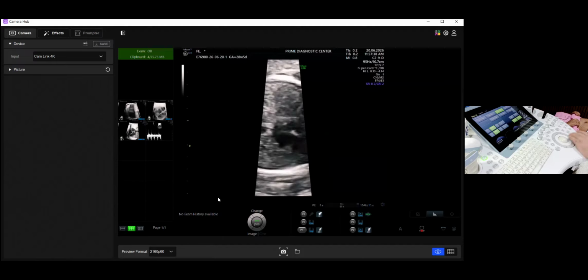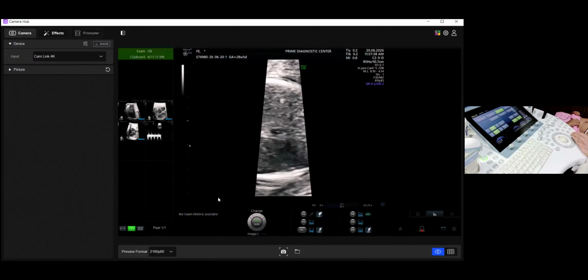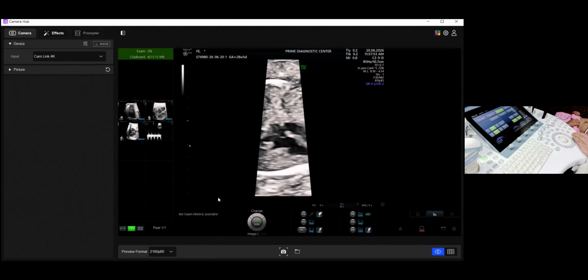So again, the left atrial appendage. So that's the left atrial appendage. Okay, that's the Coumadin ridge. That is the left upper pulmonary vein. Okay, see that again. Now you see the left atrial appendage clearly.